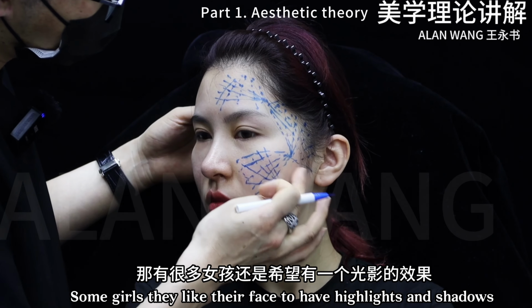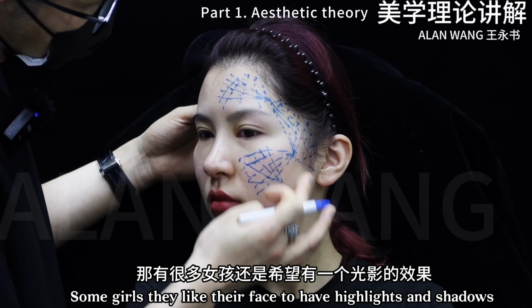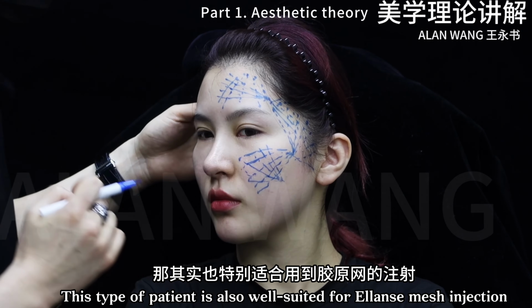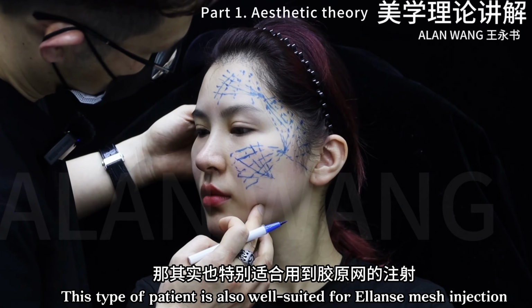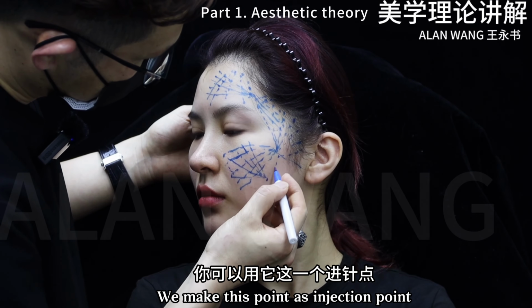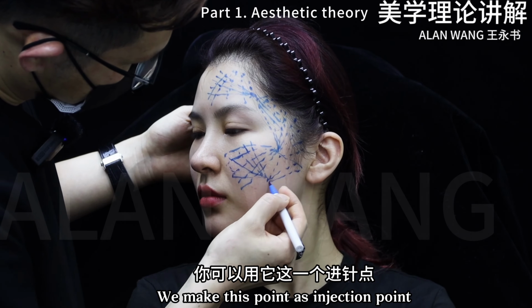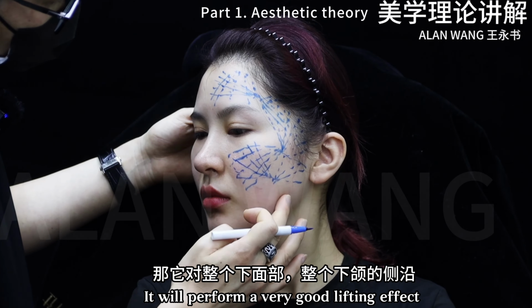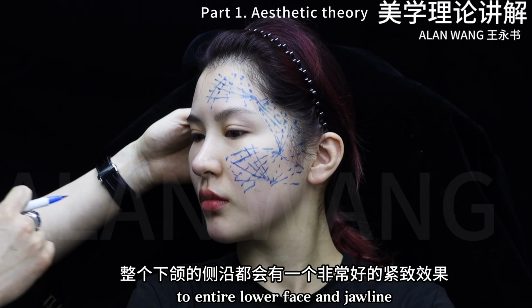Some girls like their face to have highlights and shadows, like a shadow below the zygomatic bone and a highlight on the jawline. This type of patient is also well suited for Ellansé mesh injection. Here is an easy way to do it. We mark this point as the injection point. Make a fan-shaped mesh tightening. It will produce a very good lifting effect on the entire lower face and jawline.